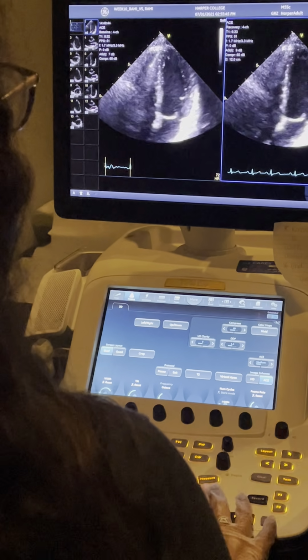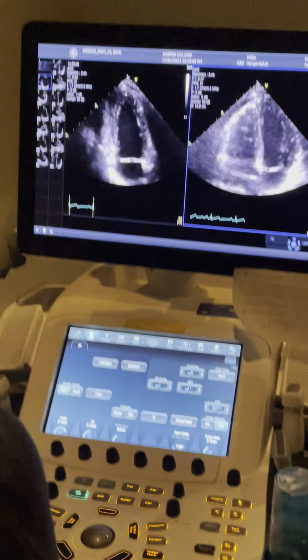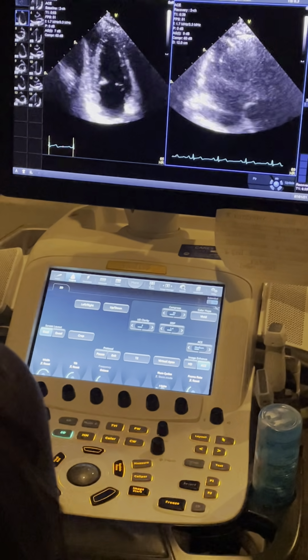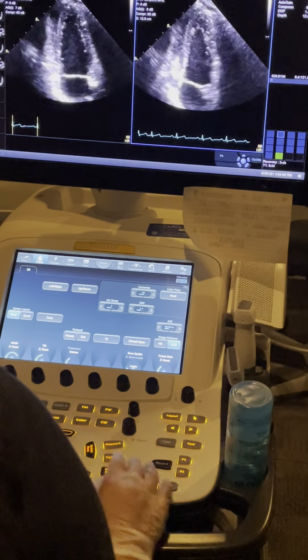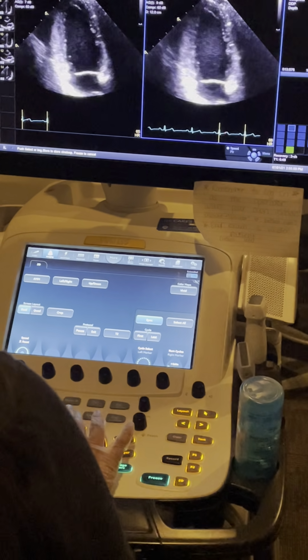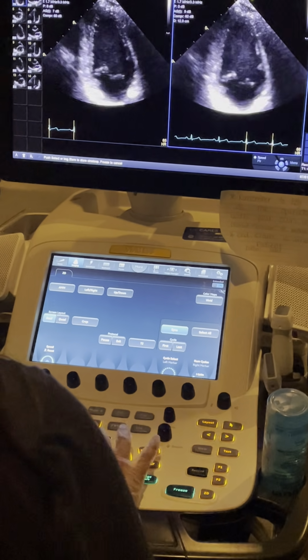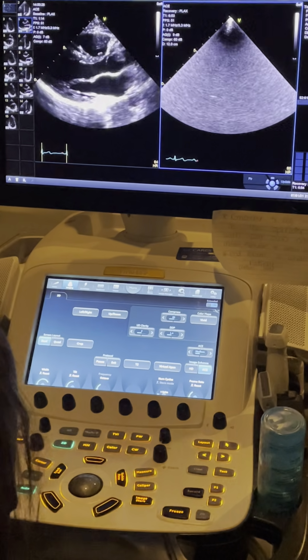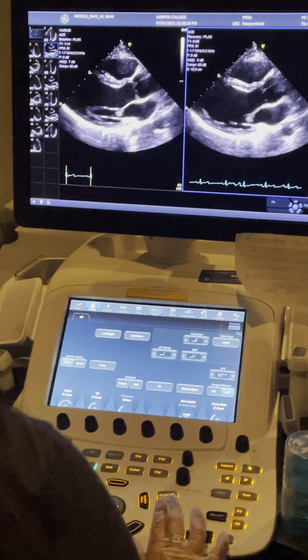And it'll be the same way that you guys have been doing it. Wow. Nice. You can see, look, they're perfectly on axis, just like it was at rest. It has to be the last one. Yes. Helps when you have an easy subject.